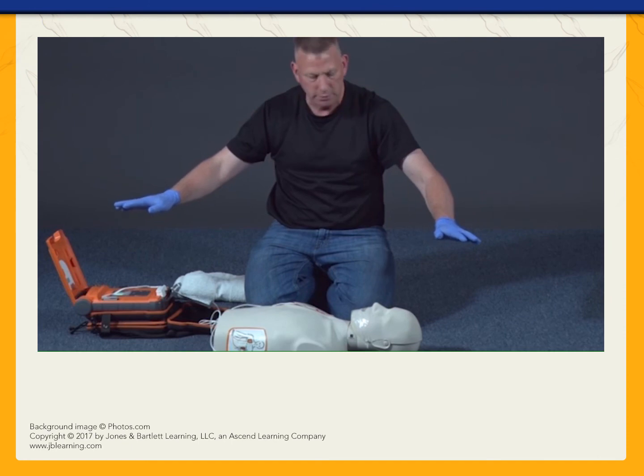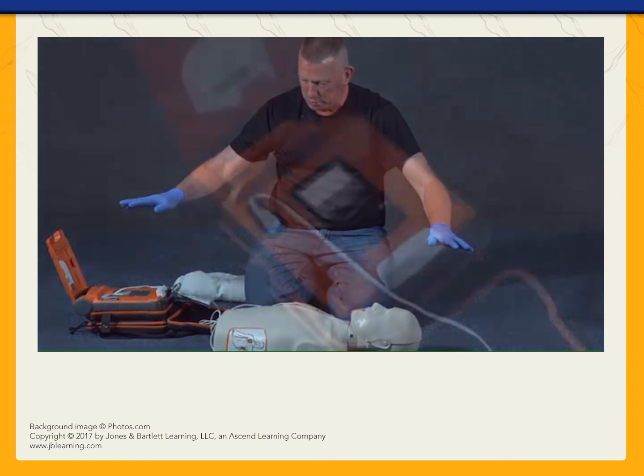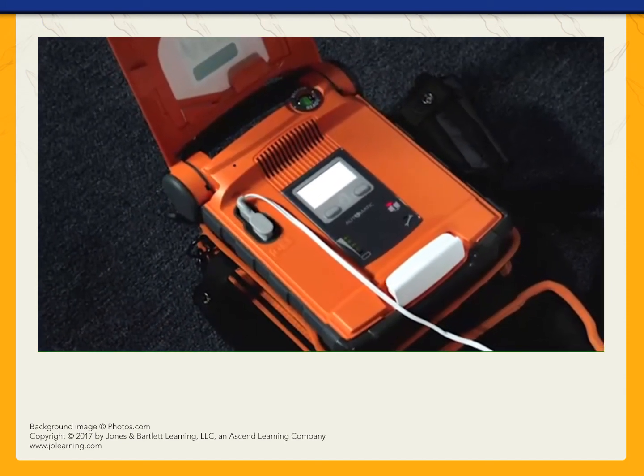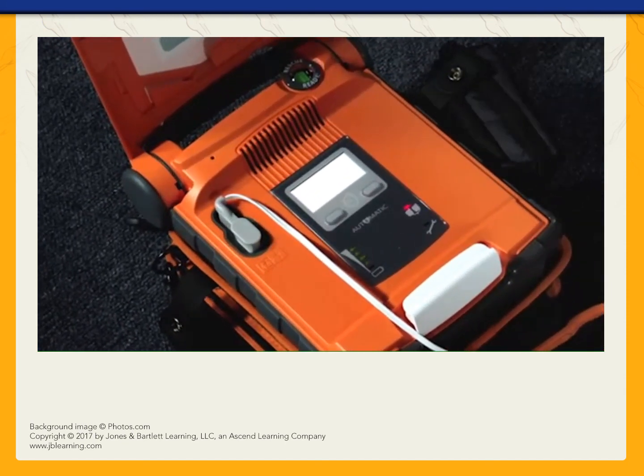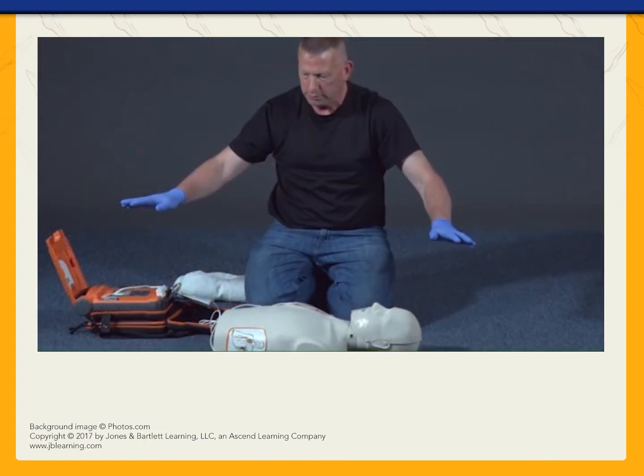Analyzing heart rhythm. Please wait. Stay clear of the person. Make sure no one, including you, is touching the person. Say, "Clear." Follow the prompts. Shock advised. Do not touch the patient. Shock will be delivered in 3, 2, 1. Shock delivered. It is now safe to touch the patient.